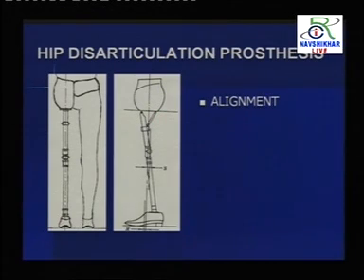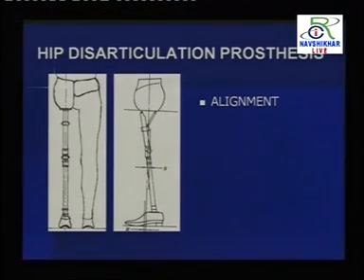We have to stabilize the knee, because to stabilize the knee we don't have hip extensors here. So that is also a problem. So in the alignment itself we have to stabilize the knee also. So it's really a challenging job, even a challenging prosthetist job. One has to work so hard, it's not that easy, along with the person who is using this prosthesis.